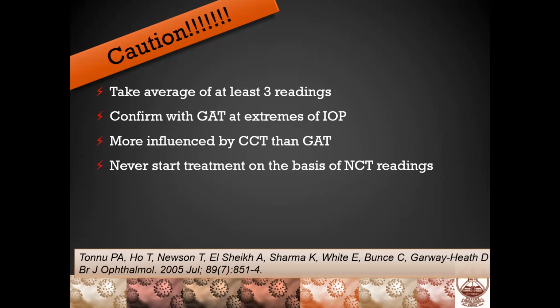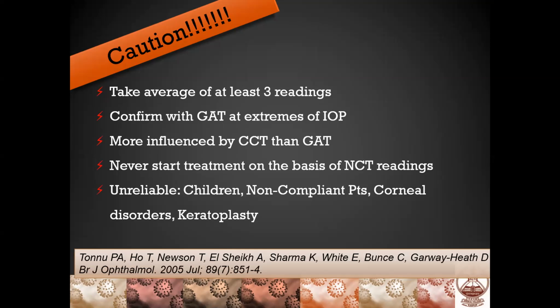on to treatment. And then it is unreliable in patients who are non-compliant, who are having any corneal disorders, in children. So there again, we cannot use non-contact tonometry. But otherwise, it is a very useful device in a busy clinic practice where you want to screen a lot of patients. Screening can be very non-contact tonometry. In fact, handheld versions are also available, but handheld non-contact tonometry are actually not that reliable. So handheld is not that recommended.